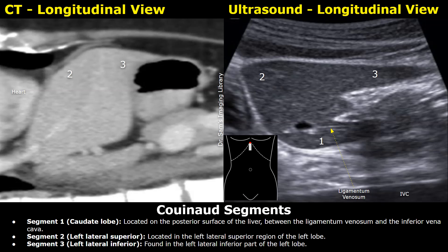We will be looking at both CT and ultrasound images. This CT image is in longitudinal plane. It is rotated in a way that it matches the ultrasound image on the right, which is also in longitudinal plane. This is just for understanding.